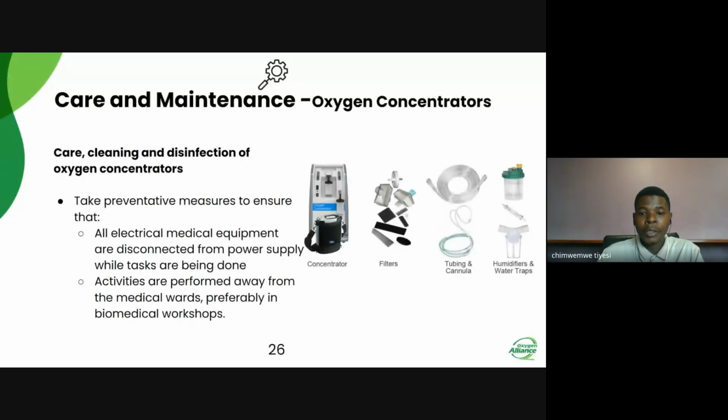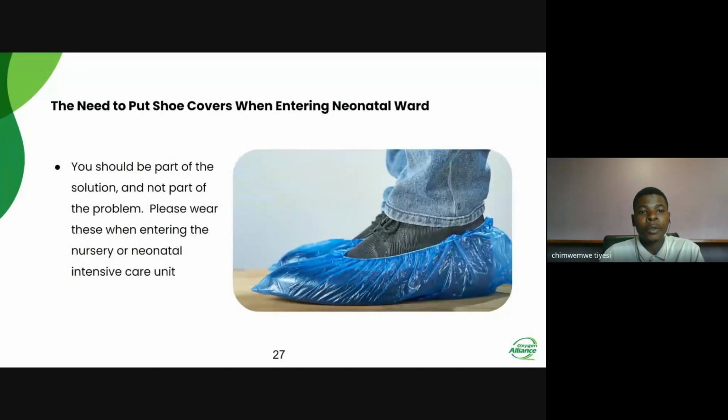Next, we are going to look at why it is important to put on shoe covers when entering your neonatal ward for assessment of oxygen concentrators or any other medical equipment, or when you want to take oxygen-related equipment or any other equipment to the maintenance workshop. You need to put on shoe-covering booties, the ones you see in the pictures. Some look slightly different, some look exactly like in the picture. As engineers, we are always part of the solution and we should not be part of the problem. So we need to wear these booties to avoid spread of infections in the neonatal ward.